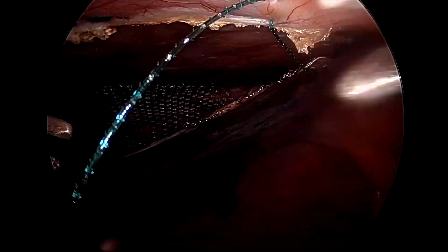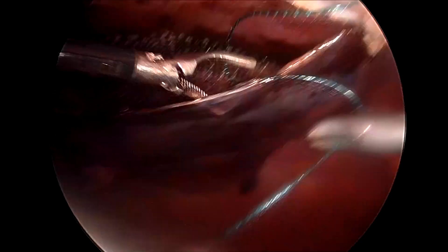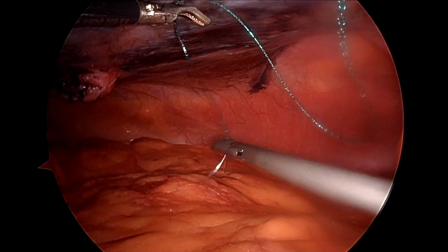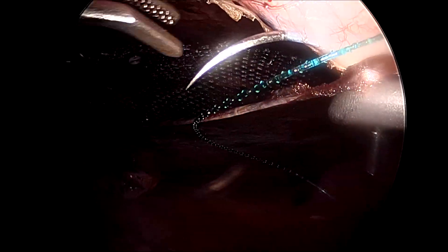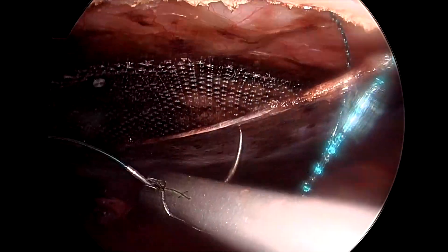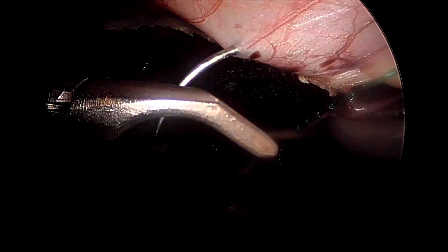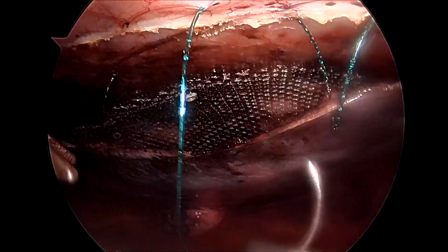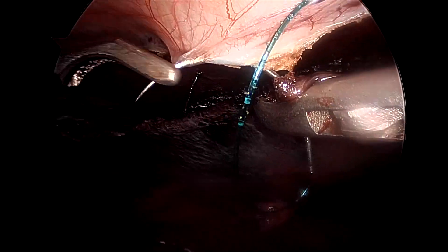This is a female patient with a short stature, so our line of incision is pretty close to our ports. Therefore this case was slightly difficult from the point of view of suturing because the ports were very close to the camera ports and vision was difficult. Again this highlights the important role of the camera person. We have used barbed absorbable number zero sutures, 15 centimeters in length, for closure of the flap.